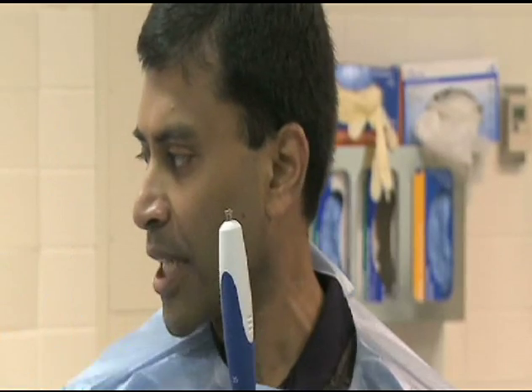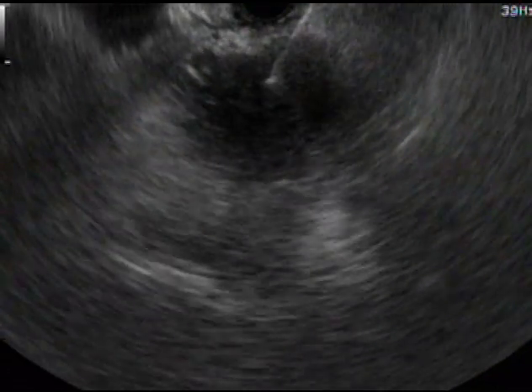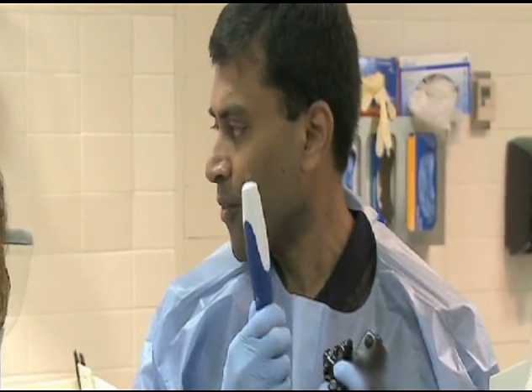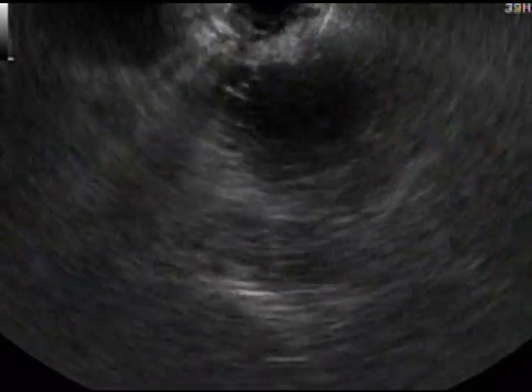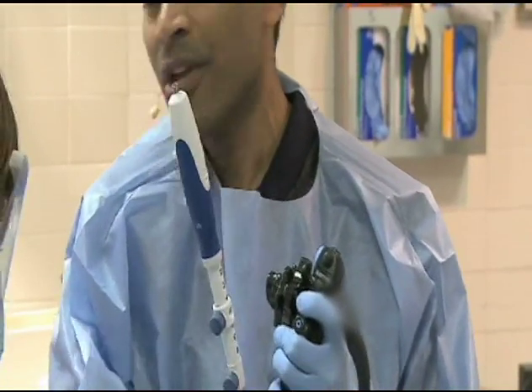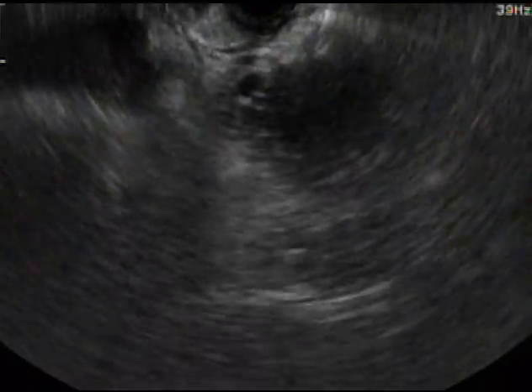We will go through this particular angle once and then subsequently retract the needle to the tip of the mass, take a different position, go back, and then take a different position. For this, the needle has to be highly flexible. I'm going to withdraw the needle to the tip of the mass and use my elevator, tip down, or tip up — or move the scope — in any combination of movements to get a different position in the same mass.